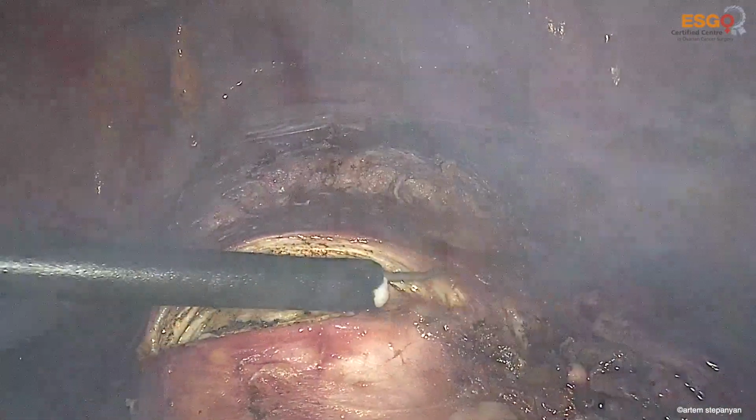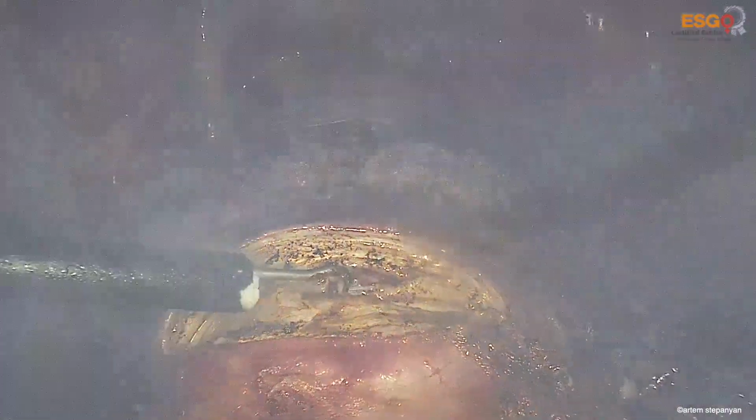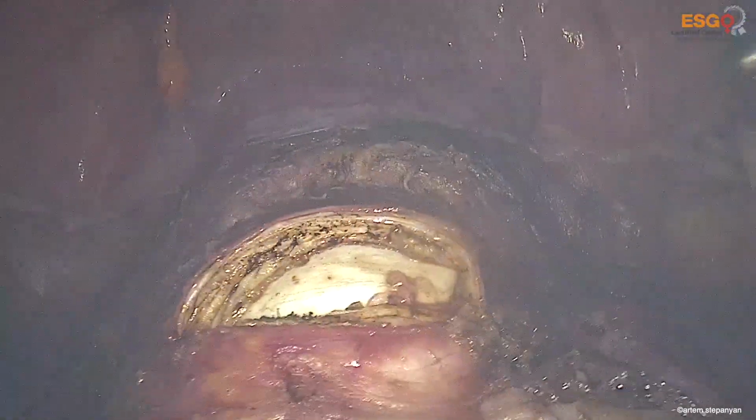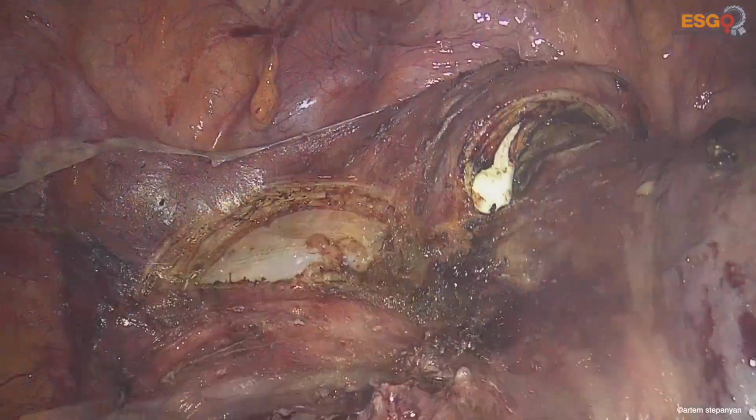The Clermont-Ferrand uterine manipulator is used. Here you see the ceramic colpotomizer that we use to visualize the vaginal fornices.